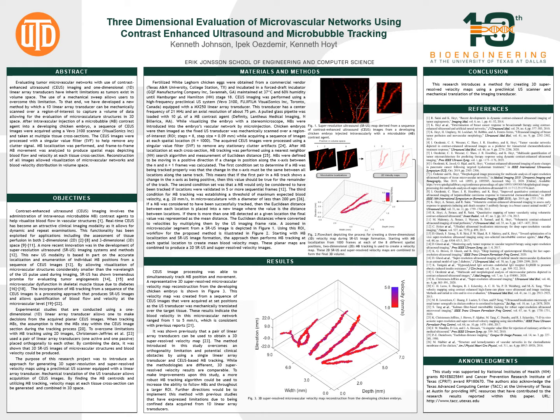The first was that the microbubble must show the same change in direction along the x-axis throughout the entire track. This means if the first pair of microbubbles show a positive change in direction, this must be true along the remainder of the track. The second criterion was that the microbubble must be tracked through 5 or more sequential frames. And the last condition for microbubble tracking was an established threshold of a maximum expected blood velocity in microvasculature with a diameter of less than 200 micrometers.